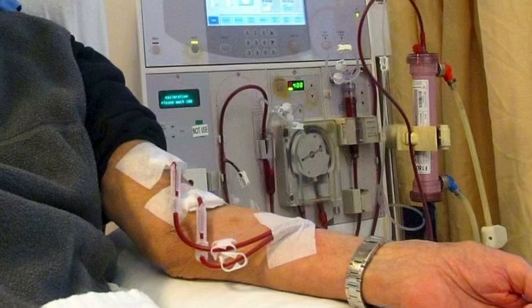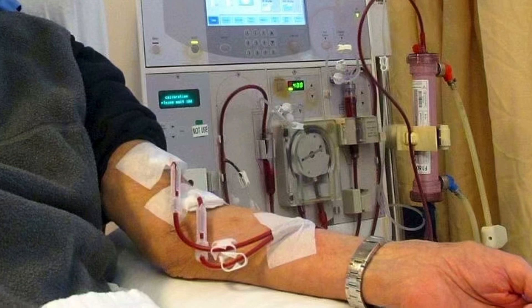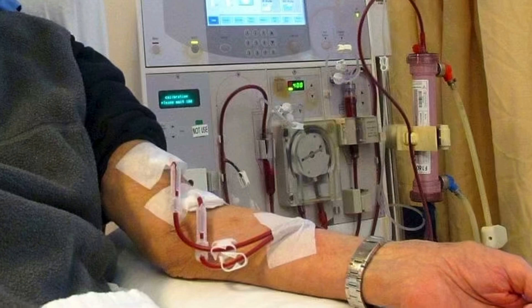Hemodialysis access grafts and fistulas are used for hemodialysis. Hemodialysis is a medical procedure that uses a dialysis machine to filter waste and water from your blood in cases of renal failure. It pretty much does the job that your kidneys used to do.